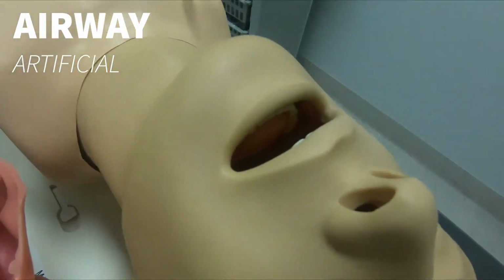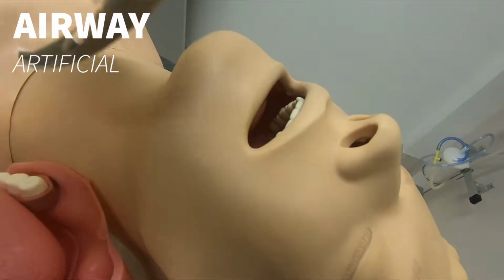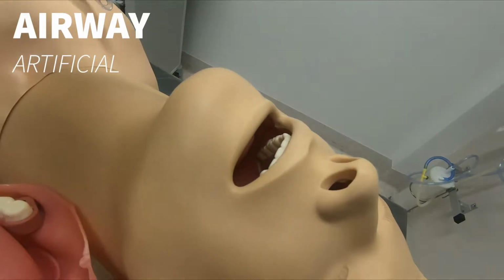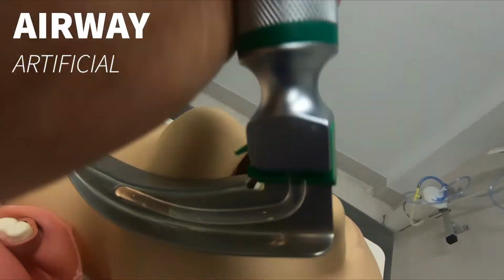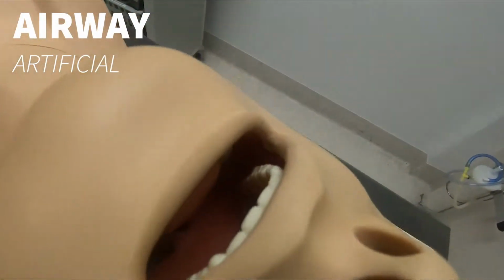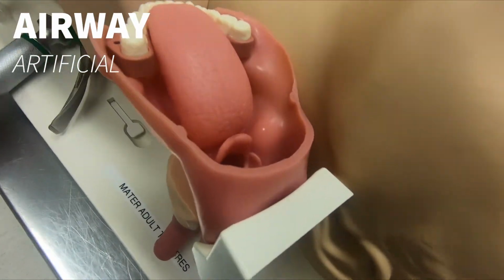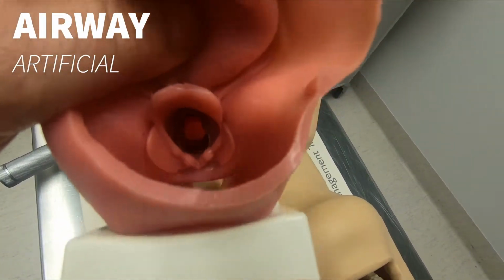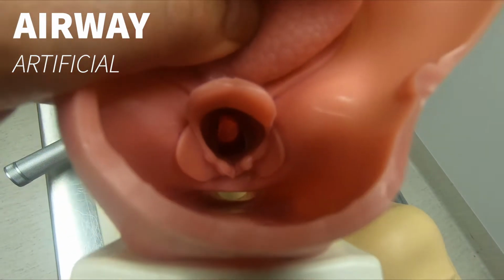And then if you look at the head here on the side, so imagine it's in there like that, you will move the whole mandible and tongue in that direction, not that extreme. You just usually do a little bit like so, but you try to avoid hinging. Yep, it's a movement like that. Very careful not to hurt the teeth. Alright, which will visualize the airway. So let me do this with my fingers. What you're trying to do is have that laryngoscope there, and then you move it in that direction, and now you have a clear open airway, and we can start advancing the tube.